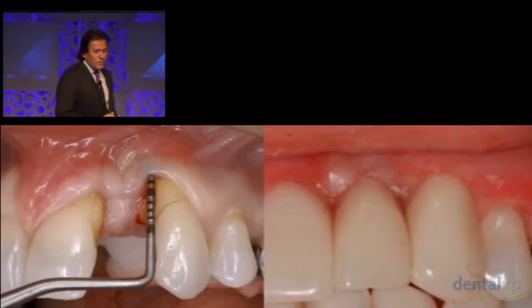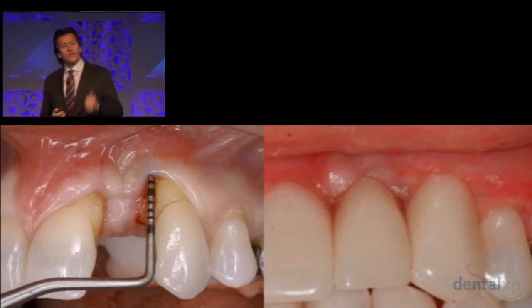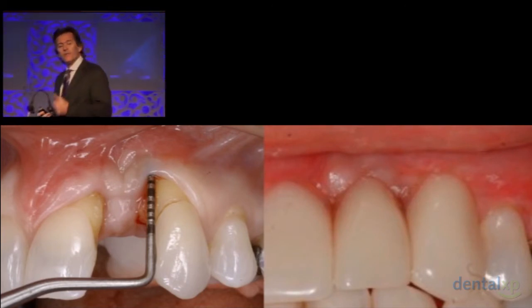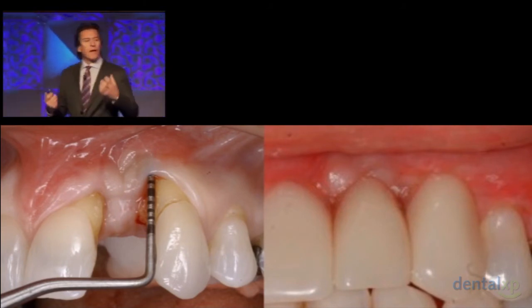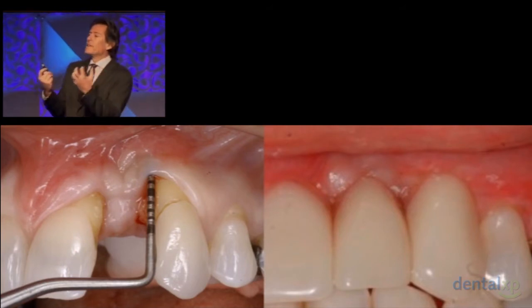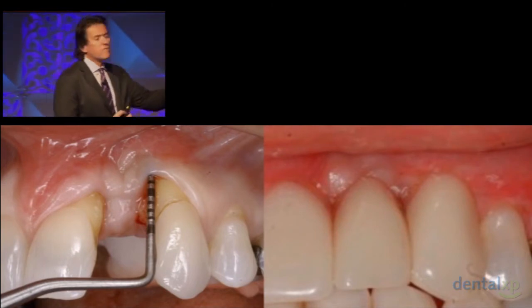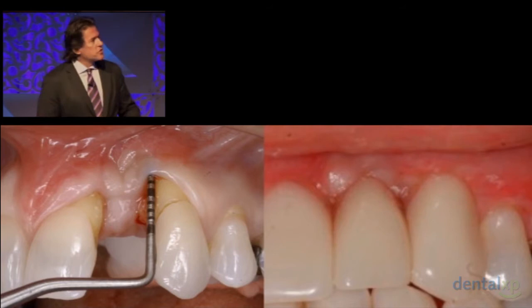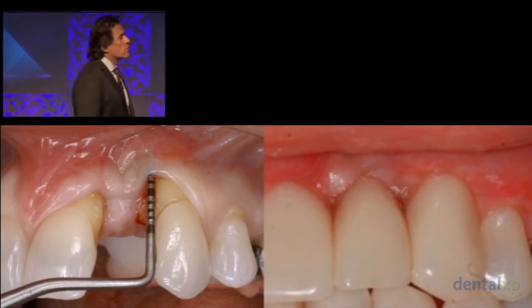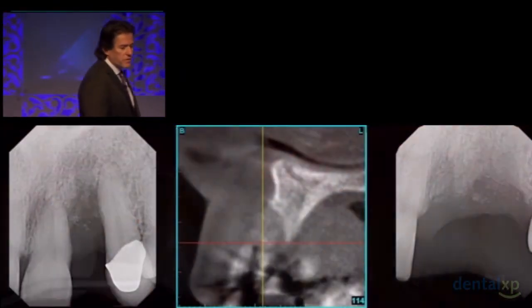So look at the process of evaluation. Interproximal height of bone is measured. We have the cone beam CT, multiple failures, scar tissue. But we're using these techniques to try to build the case back. But the best thing is that by identifying the case, I don't overpromise. I told this patient the likelihood is I can never attain the result that you see on the right screen. She should expect that she's going to be restored more than likely with artificial gingiva to reconstruct the defect.